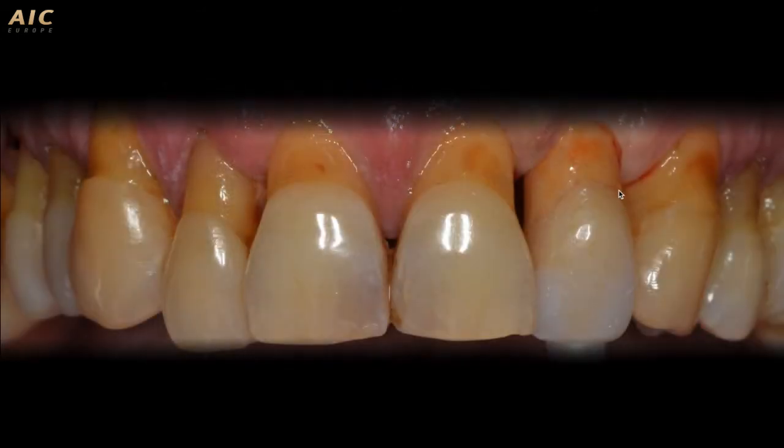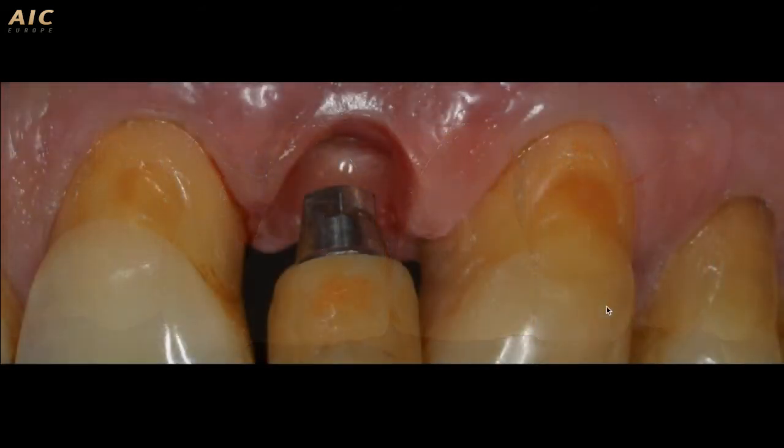This is the try-in of the monolithic zirconia with some characterized zones, and thanks to this try-in I can see what the color is, if the way that we are working is right, and in this way we can finish the work. This is a detail of the TS link abutment.